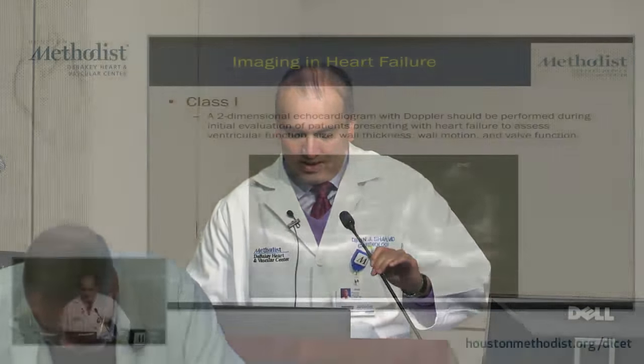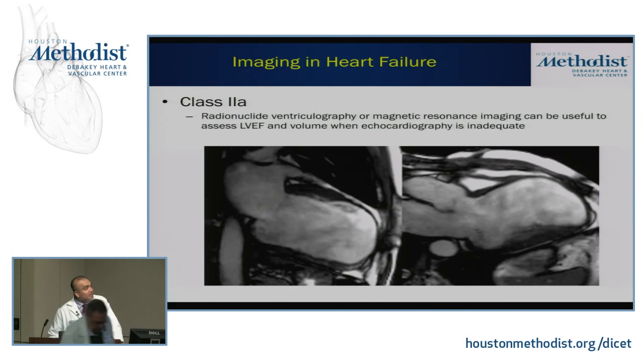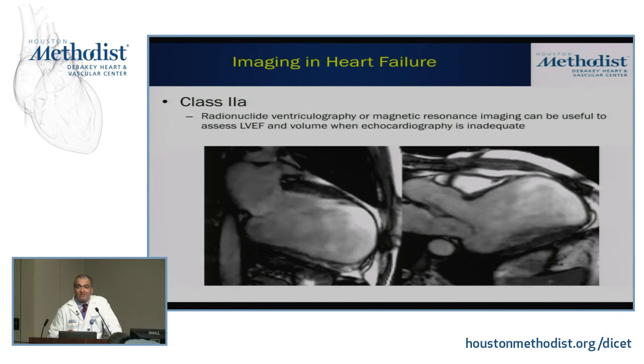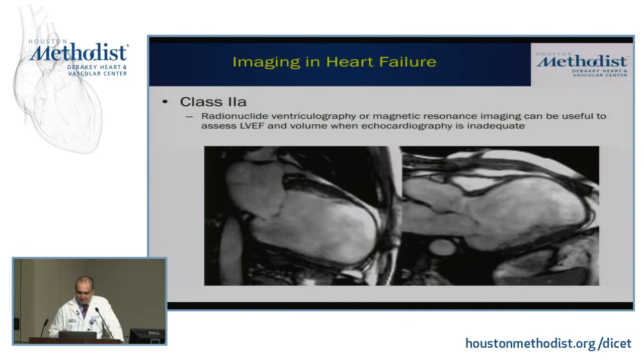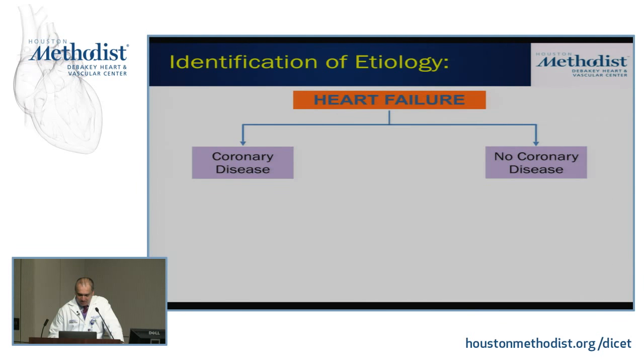And so echocardiography, again, is going to be your first line modality. And then in cases when the echo is suboptimal or there's a question, that's when you could proceed on to CMR for assessment of LV function, as well as volumes and contractility. The first thing I think is you want to know what's the patient's ejection fraction and what's their volumes.